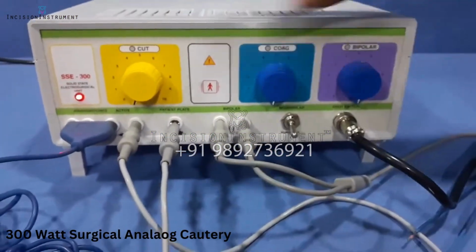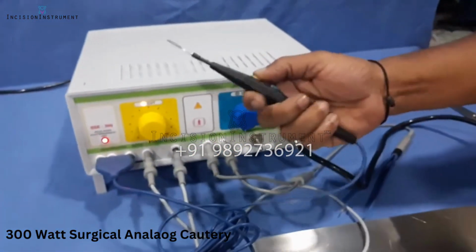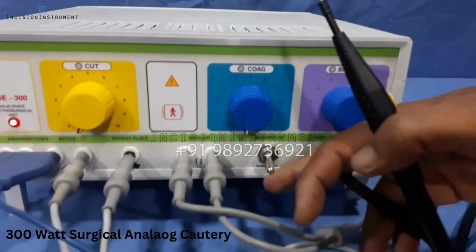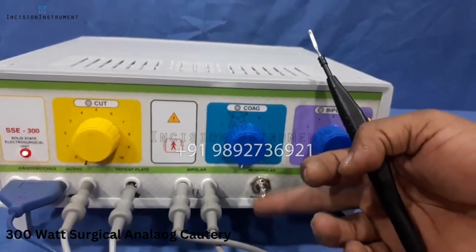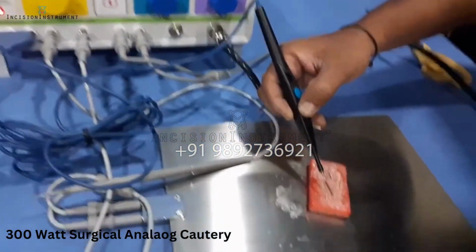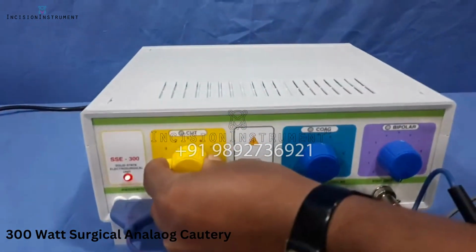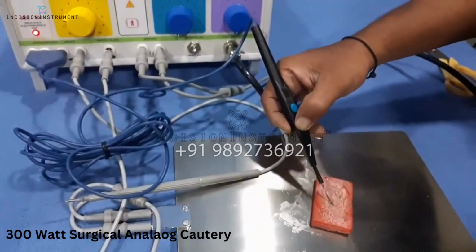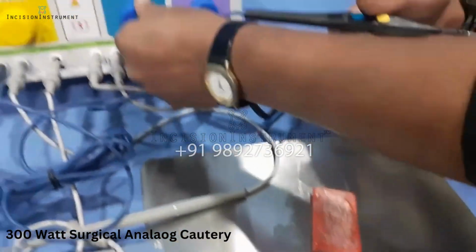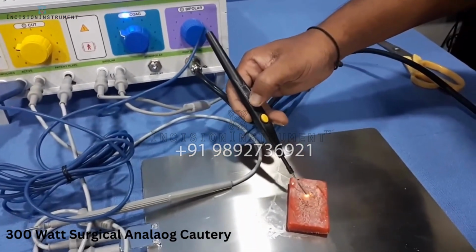So now we'll start the machine. On the left hand side you will find a hand switch pencil with cut and coag. The machine is in the bipolar mode. You have to switch it to the monopolar when you are using a hand switch or a monopolar. To increase the intensity accordingly, for the coagulation you have to increase the intensity, which was 0. This is for the coagulation.